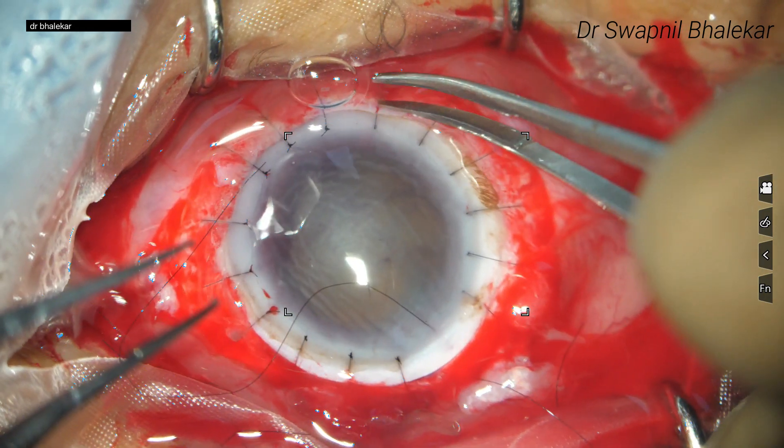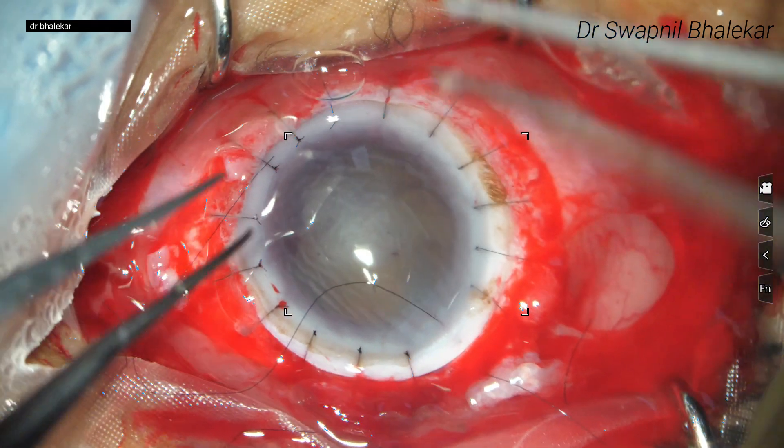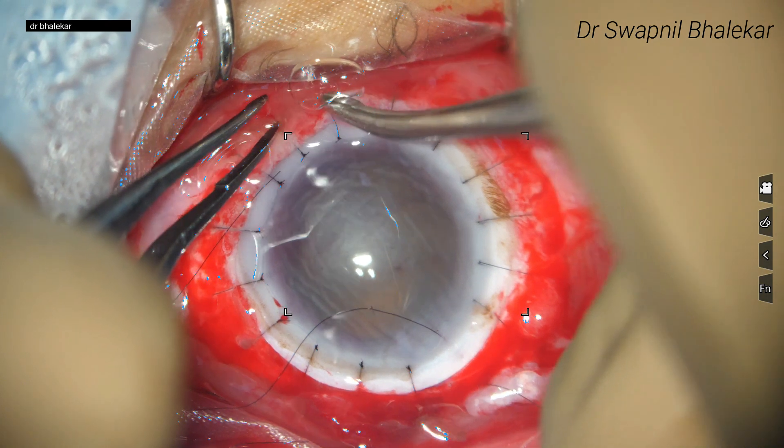You can bury the knot on the graft side as well as on the recipient side.